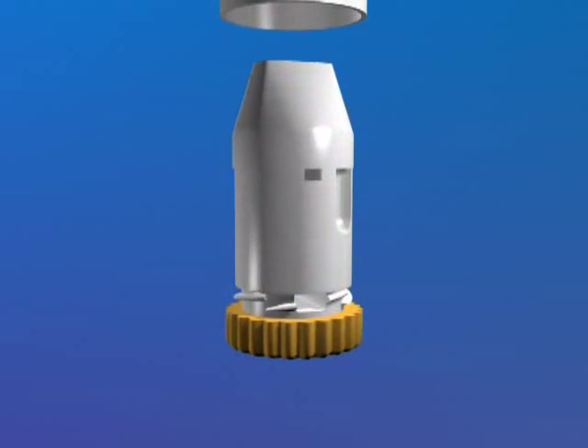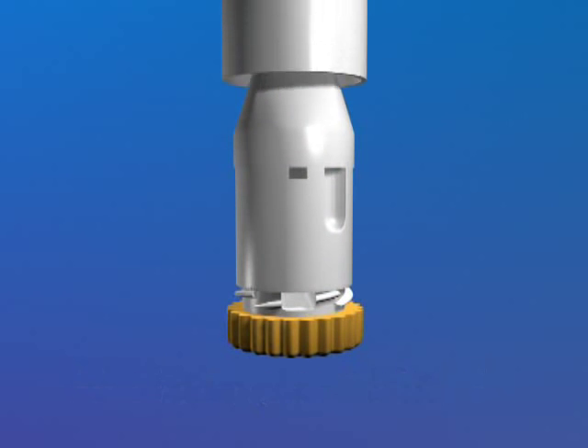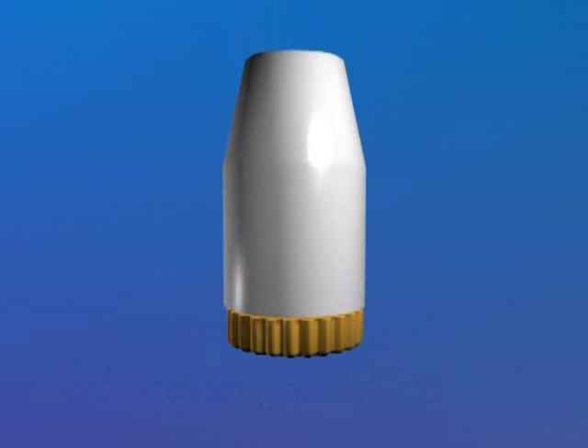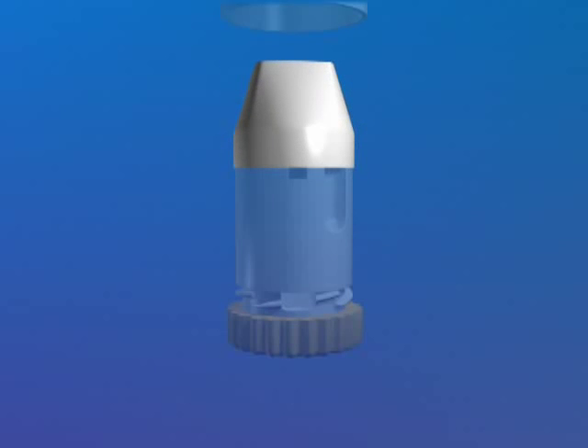First of all, let me show you the parts of the turbohaler that I'll be referring to during this demonstration. Don't worry if your turbohaler is a different colour, it will still work in the same way. This is the cover. This is the mouthpiece. This is the grip which loads the device. This is the indicator window which tells you when the number of doses left in the turbohaler is running low.